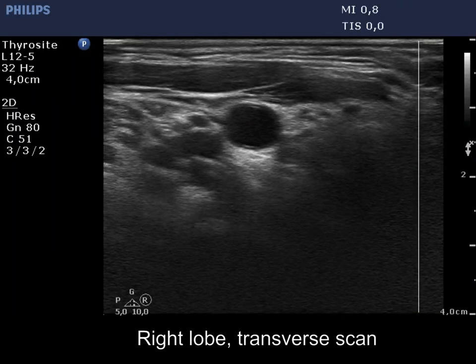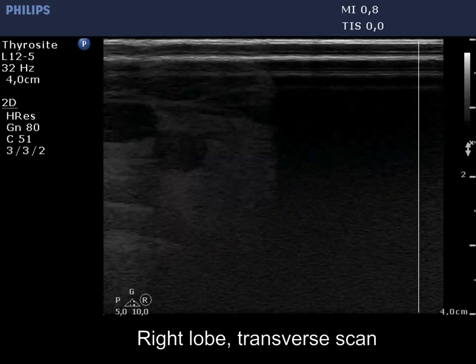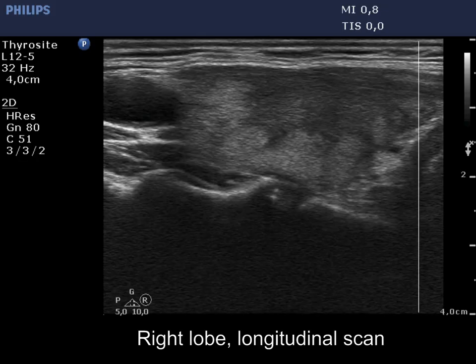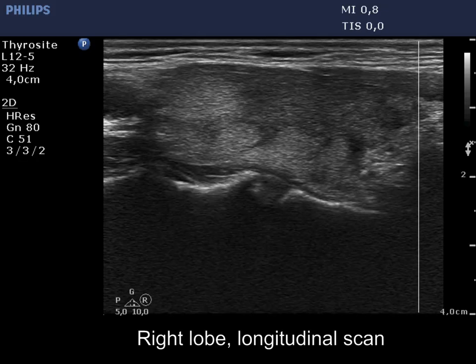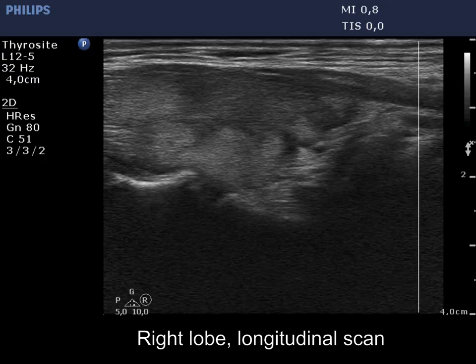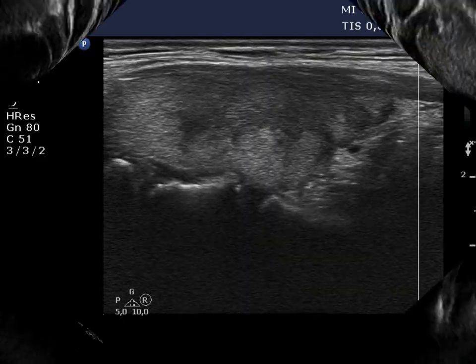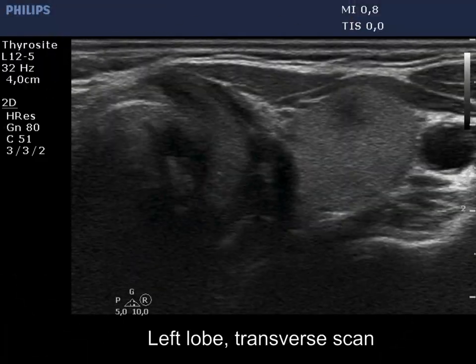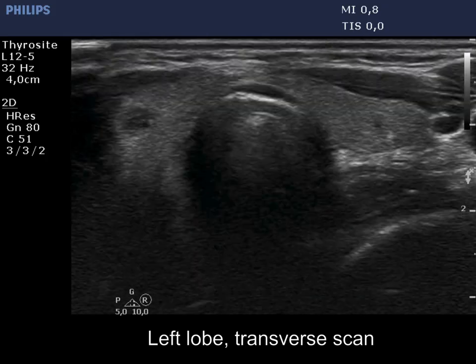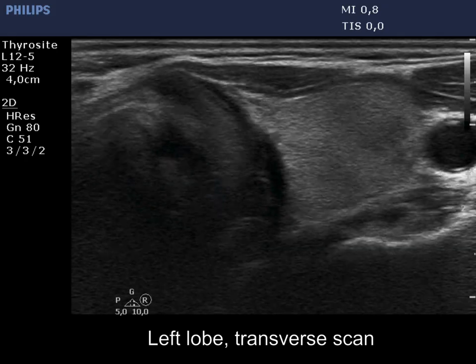Both the size of the right lobe and the proportion of hypoechoic areas decreased by 50%. The echo pattern of the left lobe remained unchanged.